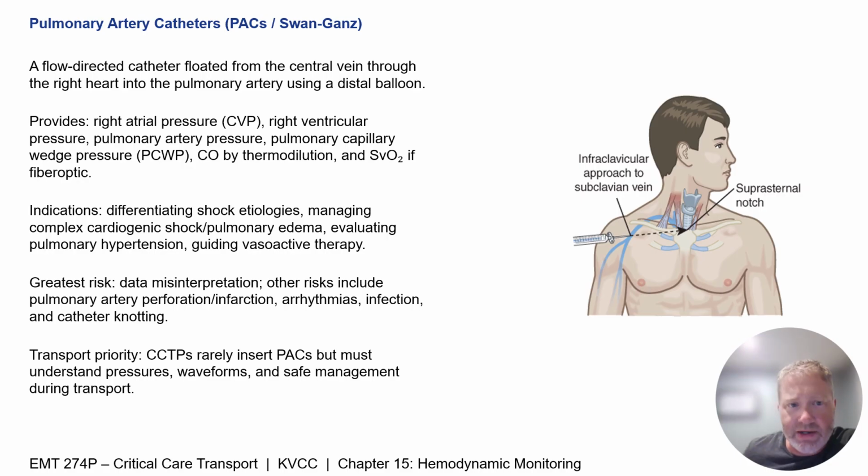Misinterpretation is a major hazard, and mechanical complications such as arrhythmias, migration, infarction, infection, and catheter-related injury remain important concerns. The priority for transport: while you'll rarely insert a PA cath, you should understand the pressures, waveforms, and how to safely manage it during a transport.